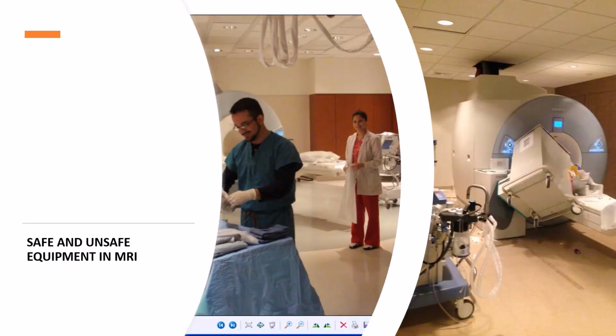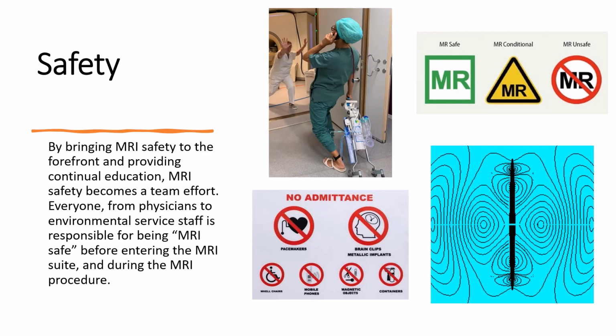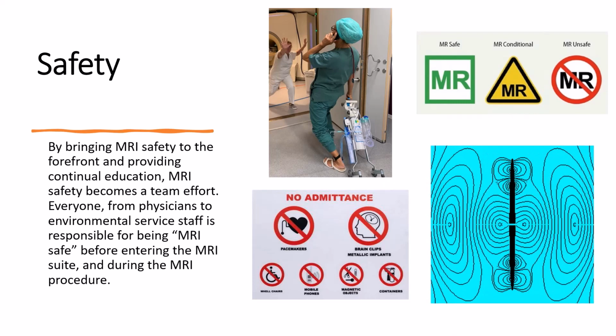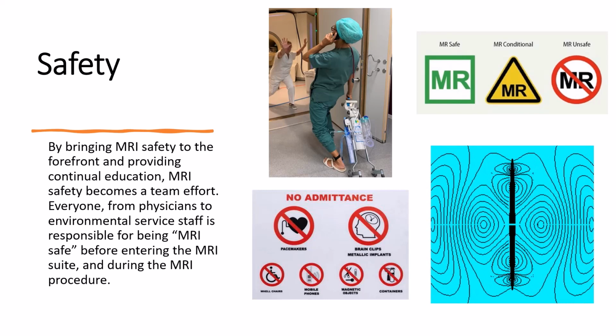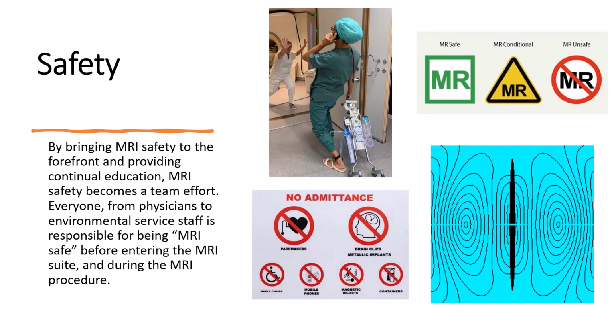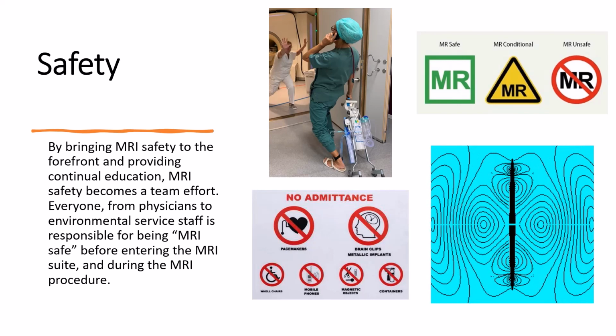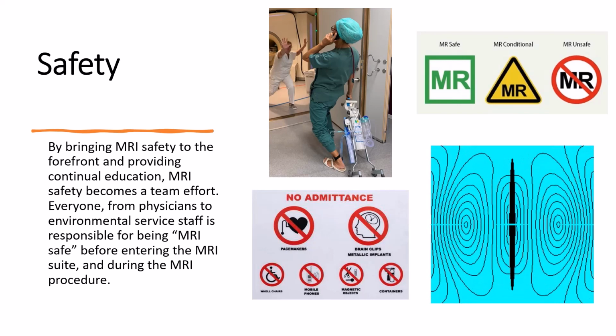So in addition to knowing about the magnet and the patients and safety, we also need to understand what type of equipment we can bring in to the magnetic field of the magnet that would be safe to utilize. By bringing safety to the forefront and providing continual education, MR safety becomes a team effort. Everyone from the physicians to the environmental service staff is responsible for being MRI safe.